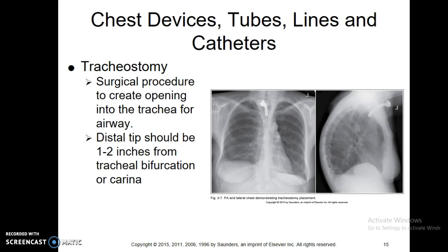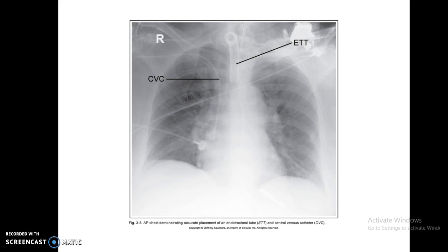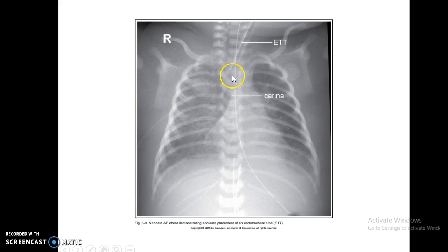Tracheostomy you can read over on that. For tracheal tubes, you will see the ET tube going through in adults. In kids it's going to be the denser, wider line that goes across. It should go towards the trachea — not all the way down into the carina, but far enough that it feeds air towards both the left and right-sided lobes.